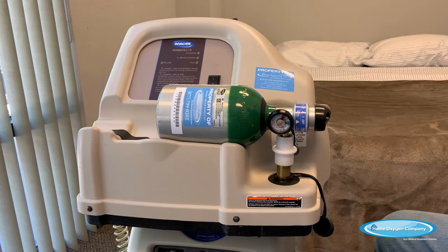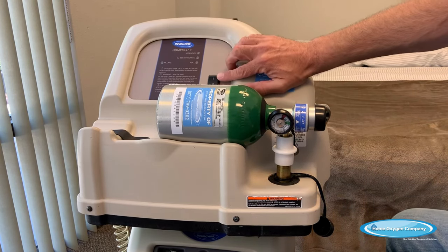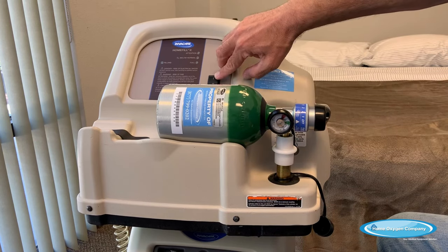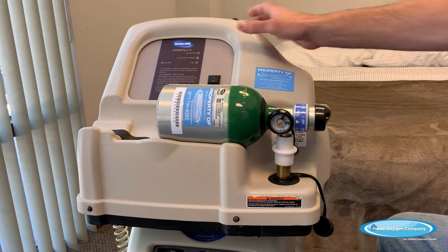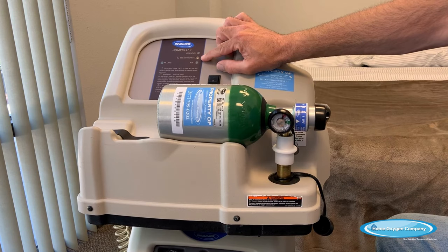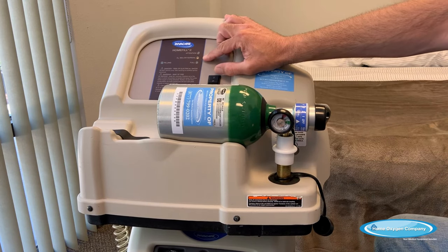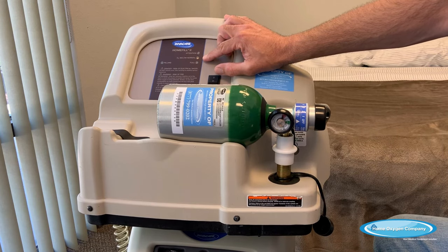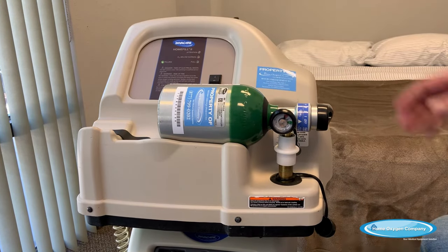Now that we've got this loaded — you've heard the click, the green dots are gone — the next step is to turn the compressor on. Much like your concentrator, you have the same on and off button on your home fill compressor. We're going to turn this on, and you're going to see it start in the O2 below normal mode. This is normal. The compressor will take four to five minutes on average to warm up and get to the normal state where it'll start filling.